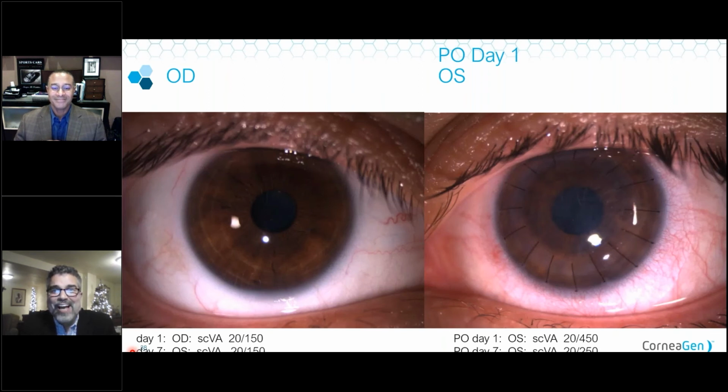Yes. Do you ever request PKP tissue and then just remove endothelium when first learning this technique if you succeed with the grip and rip? So I've thought about that and thought about recommending that. The issue there, I think, becomes that your tissue is really thick, and getting that tissue to dive so that your recipient limbal stem cells are going to grow over that cornea, you can start to get into a hump problem in that wound edge. So it's not out of the question if you can get a really deep dissection, but I think you're going to find that it's more comfortable and everything seems to fit better with a cap that's about 400 microns rather than the range of 500 or 550 microns.